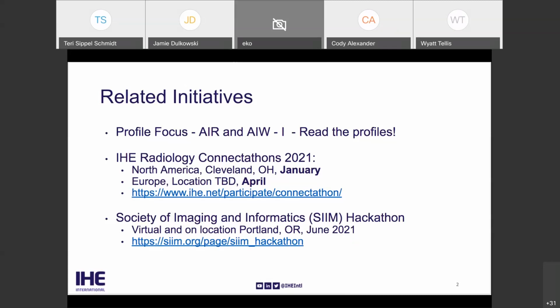And that's part of the IHE process, is learning as we go. And to that end, we have something called an IHE Connect-a-thon. Now, I would like to think that most of the people on the call are familiar with them, but if not, it's usually, all bets are off now, but it's usually an in-person event with hundreds of people where we get together with hundreds of engineers and hundreds of systems, and we connect them all together over the course of a week. And we run through some independently monitored test cases.